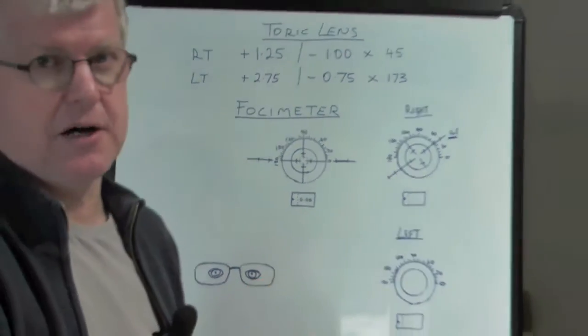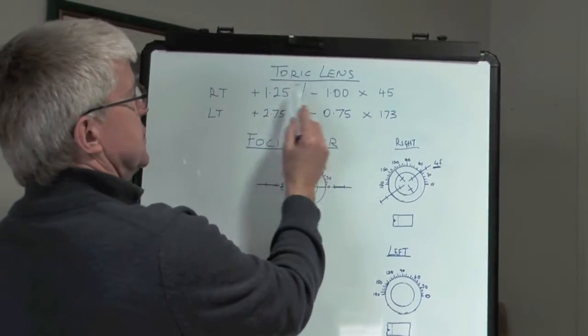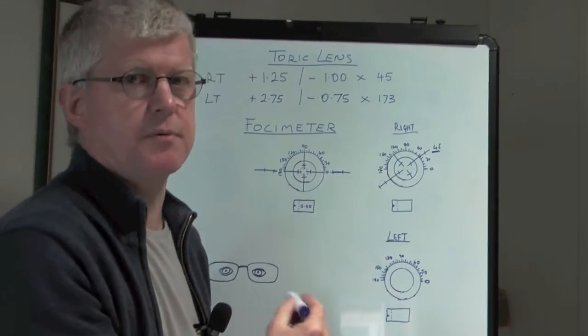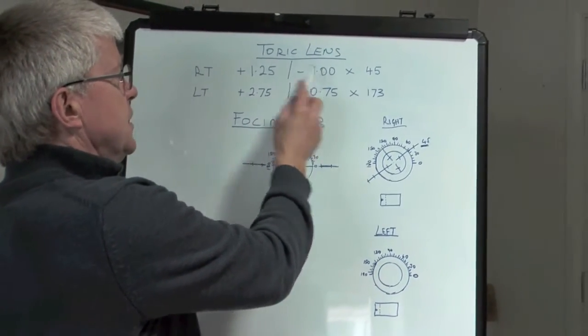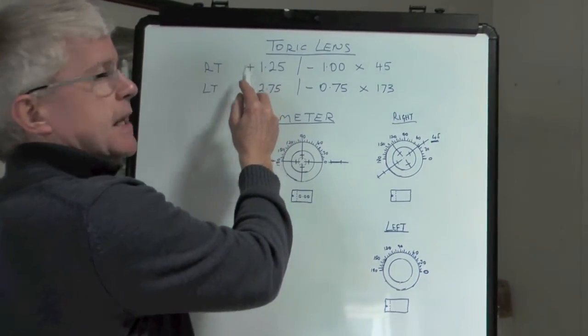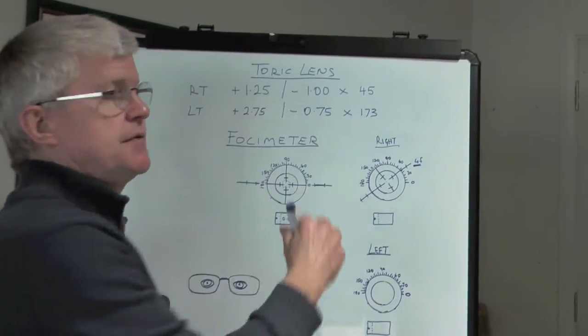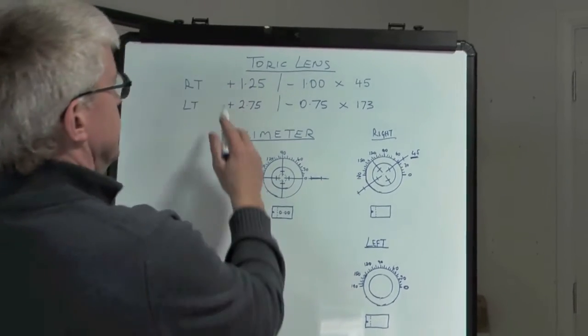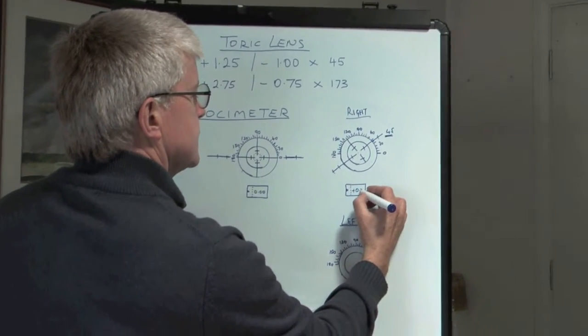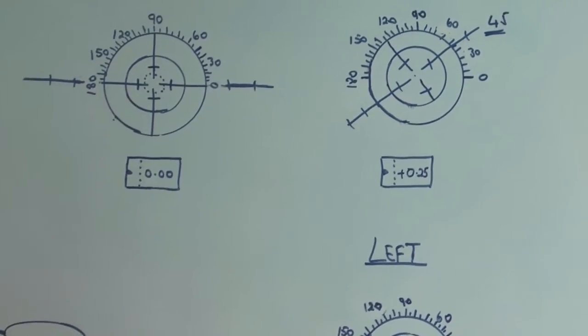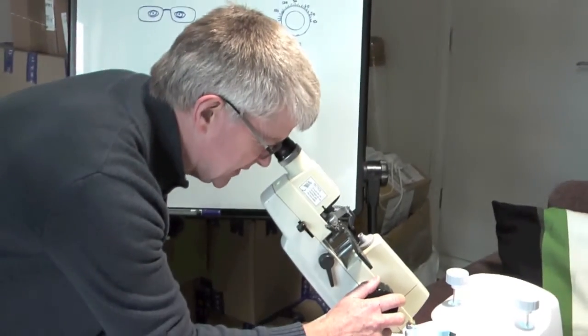Now let's set the power. The power that you want to see in this window is the sum of these two powers. When the signs are different, you take the smaller number away from the larger number, but you keep the sign of the bigger number. So you've got 1.25 minus 1, which leaves you with 0.25, but you've got a plus, so it's plus 0.25. So I'm going to set the focimeter now to plus 0.25.